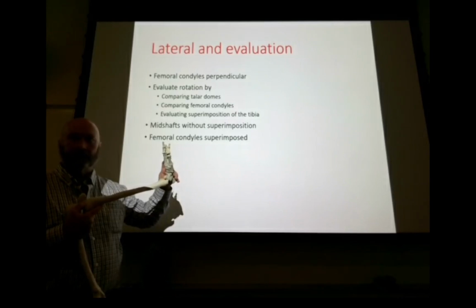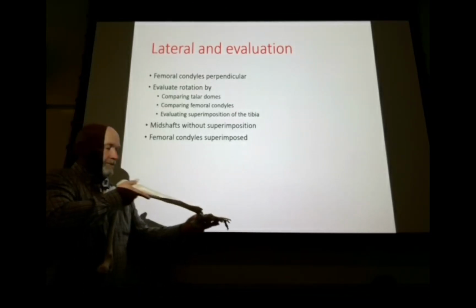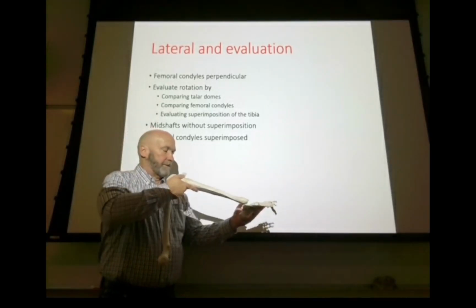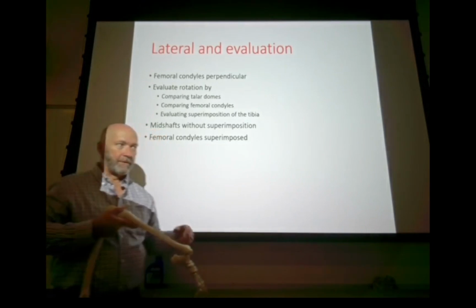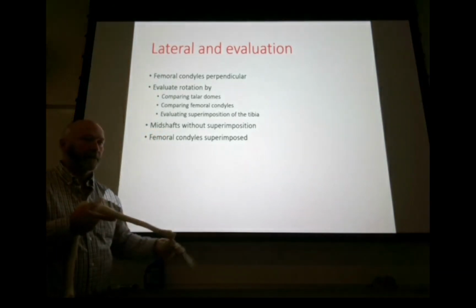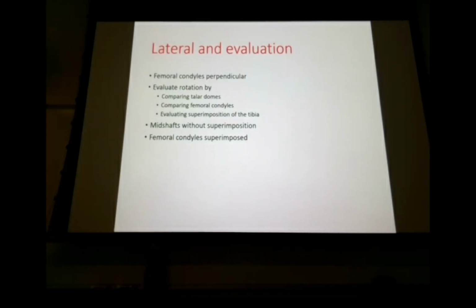It's going to be real tender, right, to lay on that side. So what you might want to do is build the patient's heel up a little bit, even if it increases the OID just a little bit, so that you don't have that rotation. That's for the lateral of the ankle. For the lateral of the tib fib, again, you're not going to have a perfect superimposition because of the divergence of the central ray.